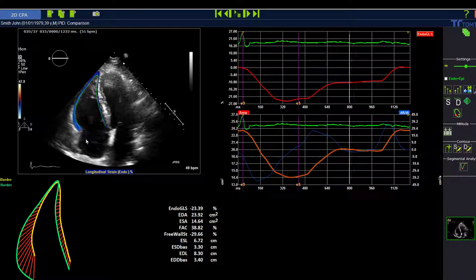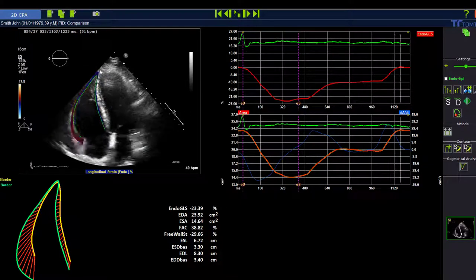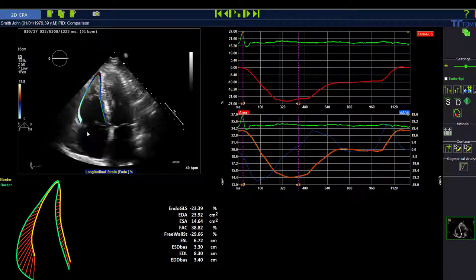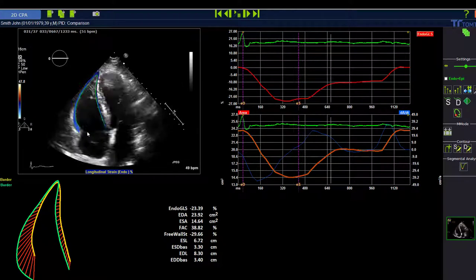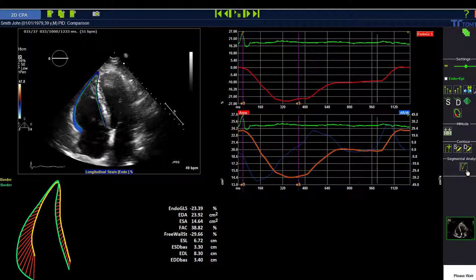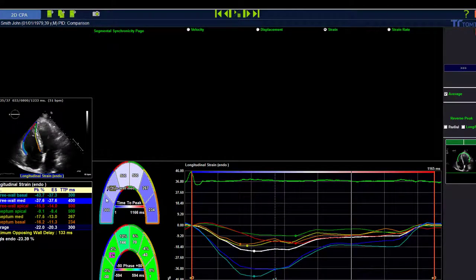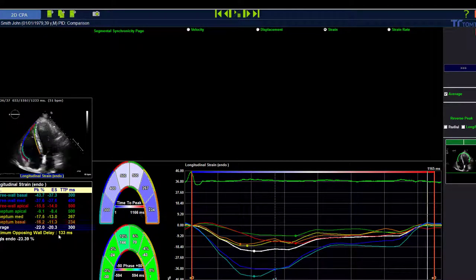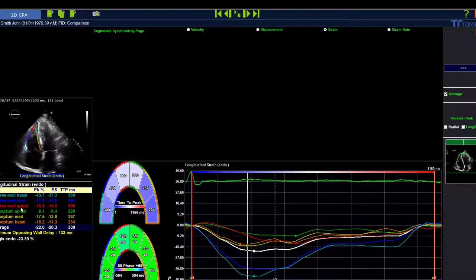Another change in 2DCPA8 is that the analysis for the right ventricle is now performed in six segments. After drawing the contour, you can go to the segmental analysis, where you have three segments for the free wall and three segments for the septum.